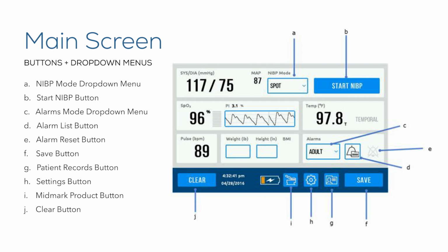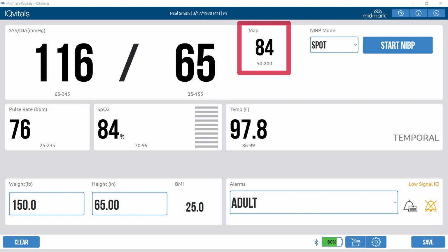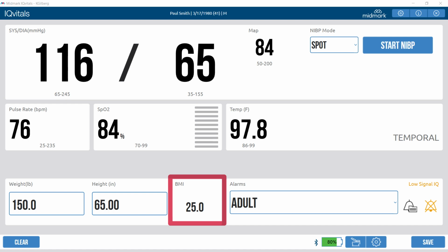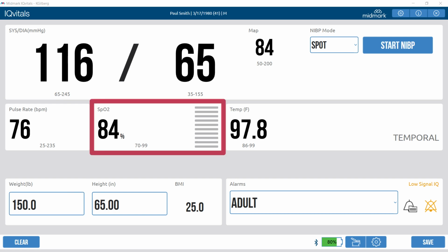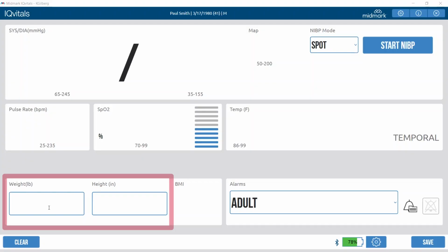The IQvitals Zone main screen displays the following patient data: blood pressure, mean arterial pressure, MAP, temperature, body mass index, BMI, battery power icon, patient height, patient weight, SpO2 and pulse rate. Manual entry of data: buttons that have a blue outline and no arrow are data entry buttons and allow for data to be entered manually.